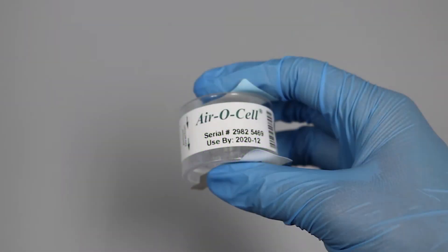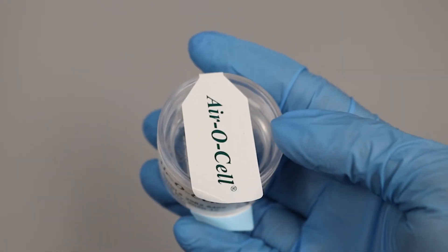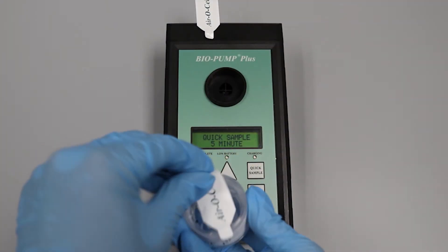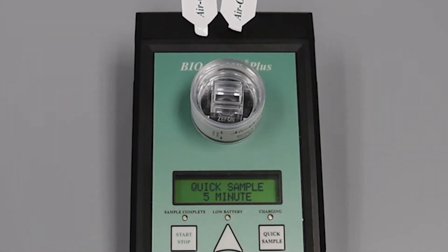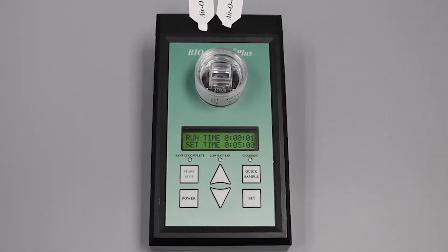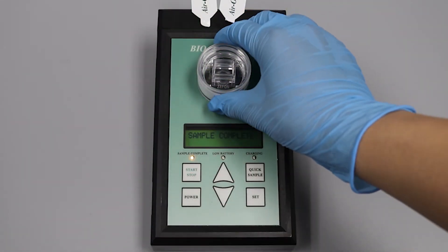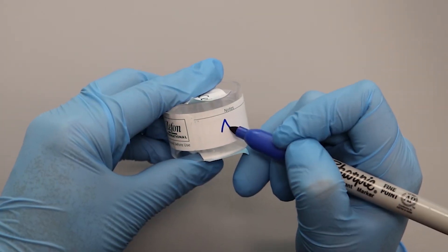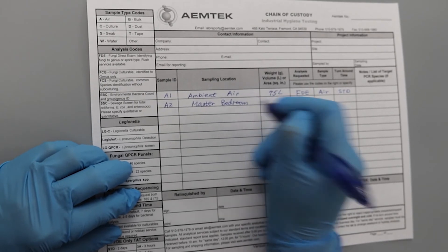After you've chosen the appropriate sampling time, take out an Air-O-Cell, verify the use-by date on the cassette, and make sure that the security tape is attached properly and undamaged. Take both security tapes off and retain for resealing. Place the Air-O-Cell on the pump with the rectangular port facing upwards. Press start to begin sampling. Once completed, the pump will beep, the display will show sample complete, and the yellow sample complete light will turn on. Remove the cassette gently by pulling upward. Seal the cassette with the security tape. Label the cassette with location and date, then record the cassette serial number, location, and date on the chain of custody form.